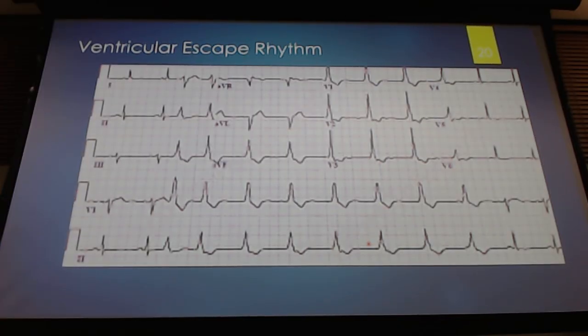So is this a ventricular escape rhythm? Maybe that's right, because we have, look, P, QRS, a little bit of a T, P, QRS, and then something happens here. It tried to fire. We don't have a P wave here, so something tried to fire. It didn't quite fire, so now we have this escape rhythm that's occurring.